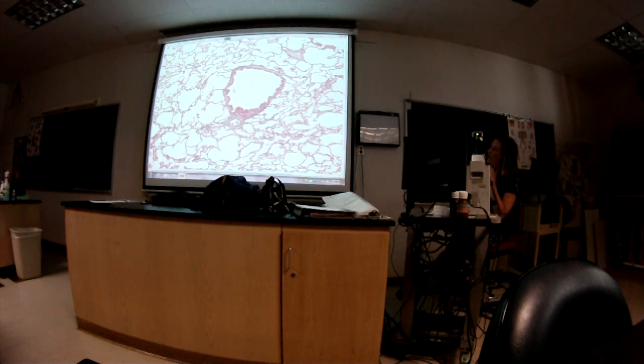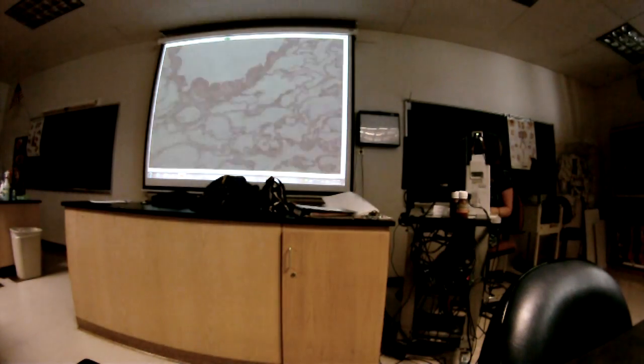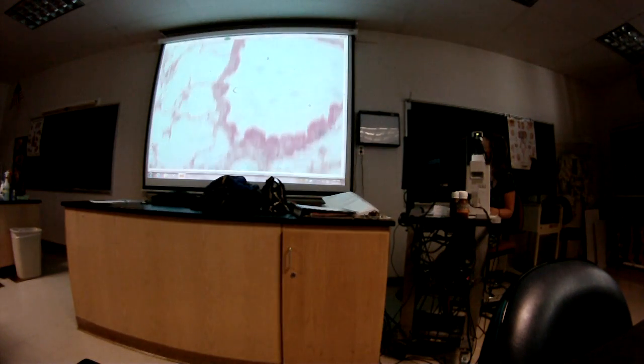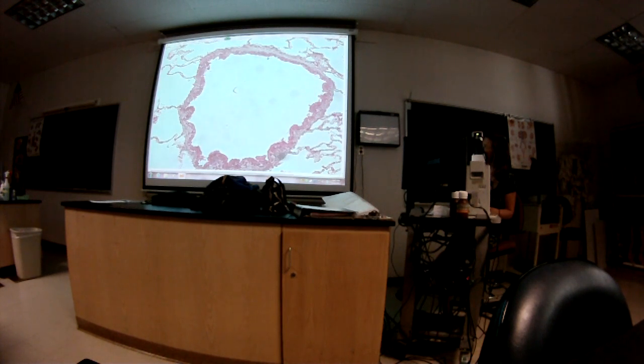All right, here's another one, a little smaller. Okay, so that's the same as question 9. So what is this structure? Okay, let's go on to question 10.